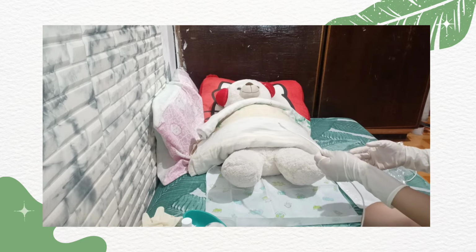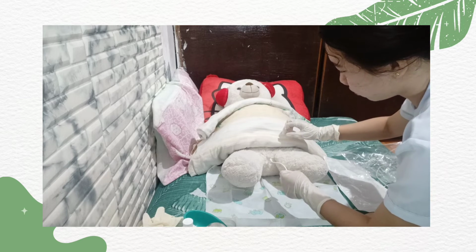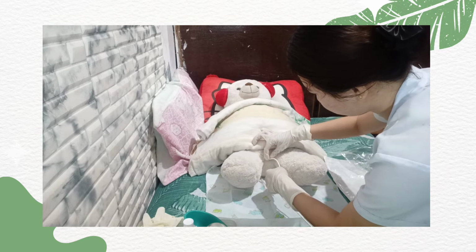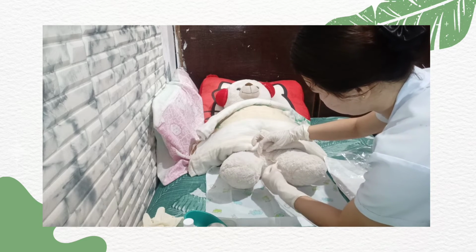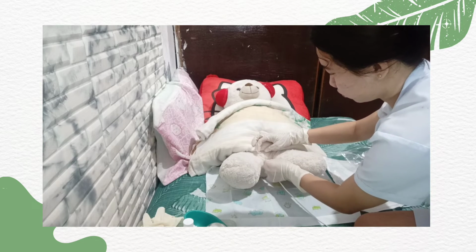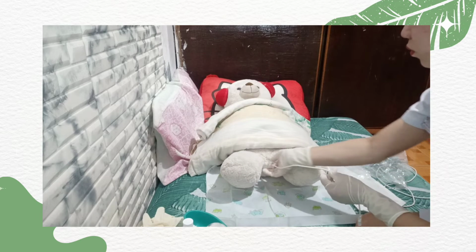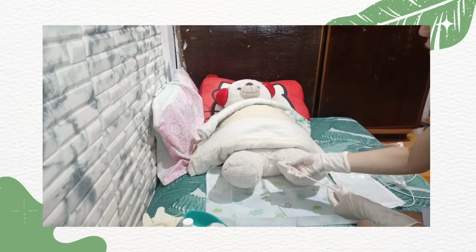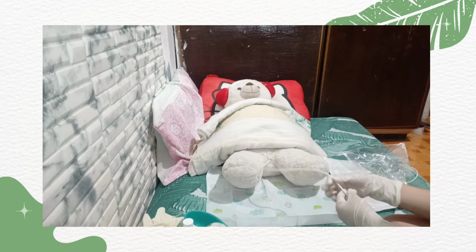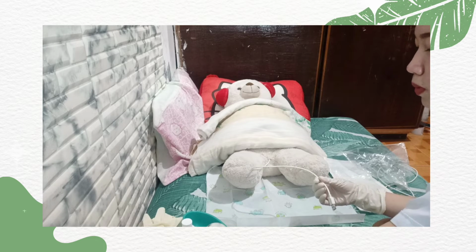Now I am going to insert. Ma'am, breathe deeply, please. When we have obtained the specimen, we are now going to put it in a specimen container.